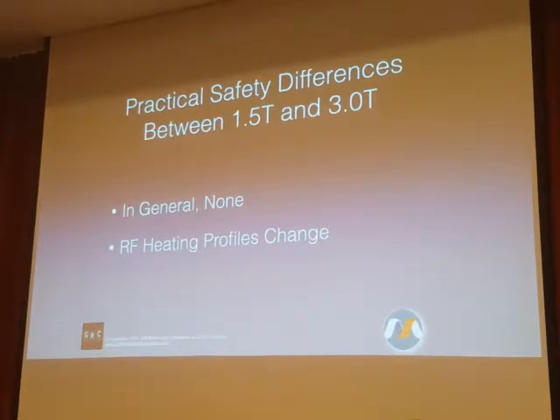because the frequencies are so small, which means the wavelengths are so enormous, which means the conductor length that is going to experience resonant circuit heating is so long, we'd have to put, like, a spool of cable that went out into the next room to get something of appropriate length, that it would be the right antenna for those low field systems.